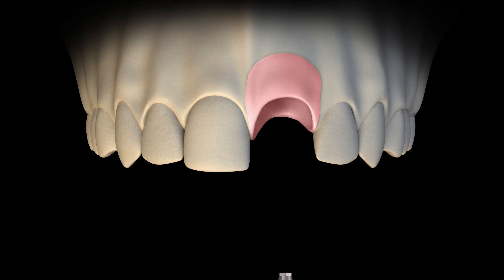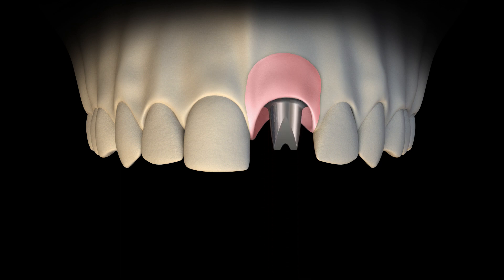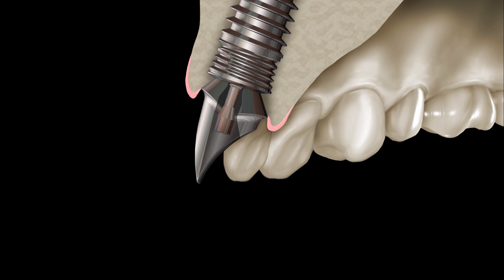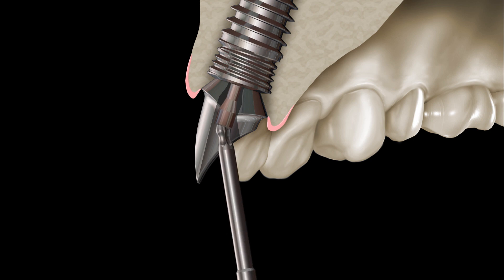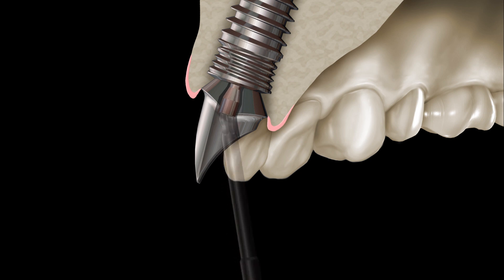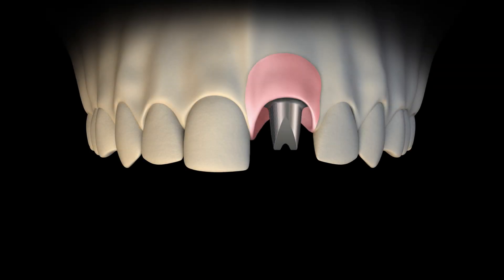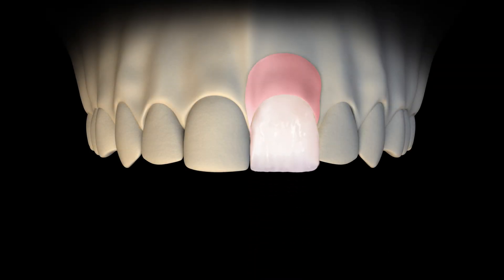Place the abutment into the stone model to verify the fit. Insert the fixation screw with an angled ball tip screwdriver. Place the crown into the stone model to verify fit.